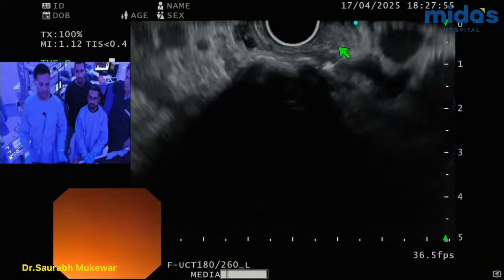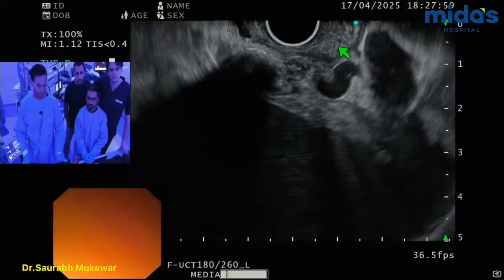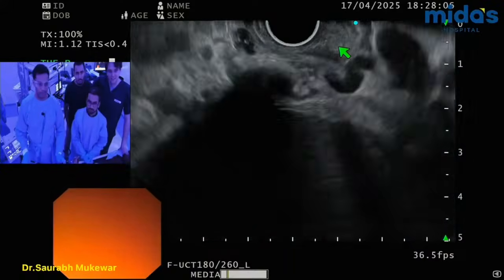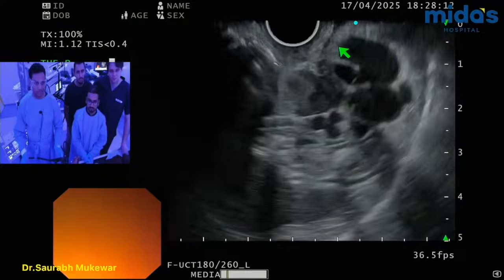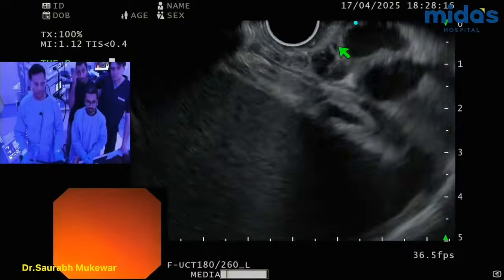Now, here's the thing, right? Post this, you see the entire thing is completely gone. There's really nothing left, right? And we are done. And I can't even trace the outflow there very easily, which is somewhere here, okay? So now, wait. Guys, sorry. Can you guys wait? I may have to do something.